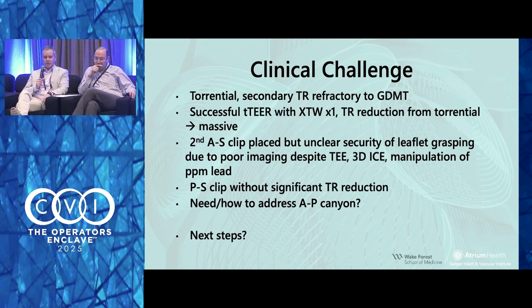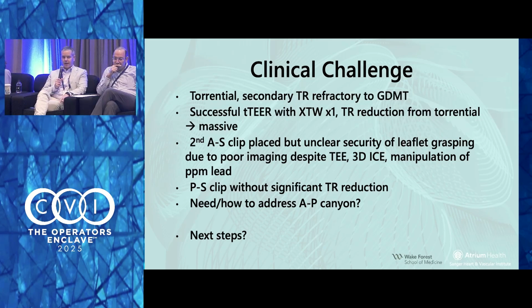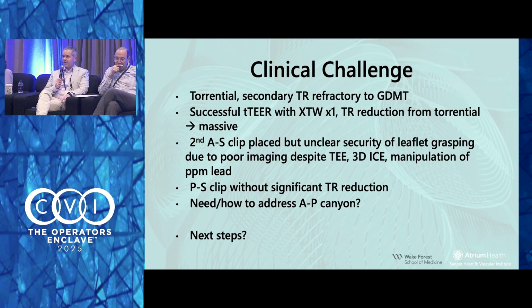I would commend you that because you didn't have confidence in the septal leaflet, you didn't try to put something there, because you can definitely make things worse with an SLDA and make things even more complicated. So sometimes, rope-a-dope, taking your licks and then coming back swinging on another day, I don't think is wrong as long as you realize what you're doing. So I think that's a strategy as well.